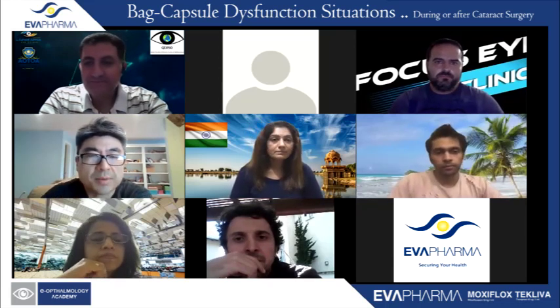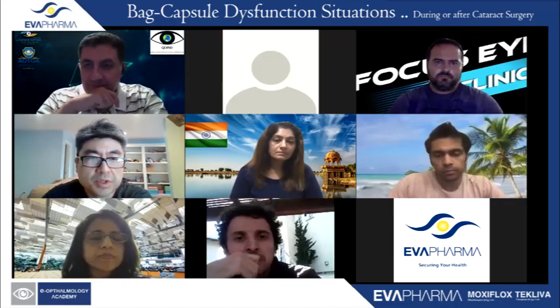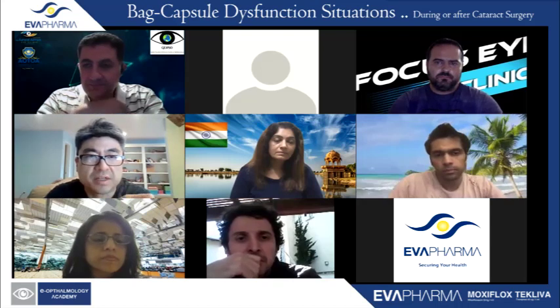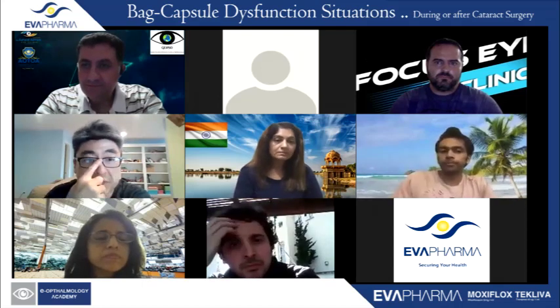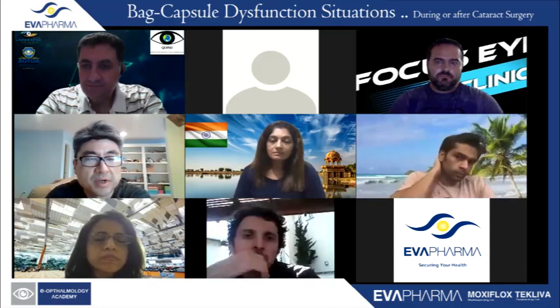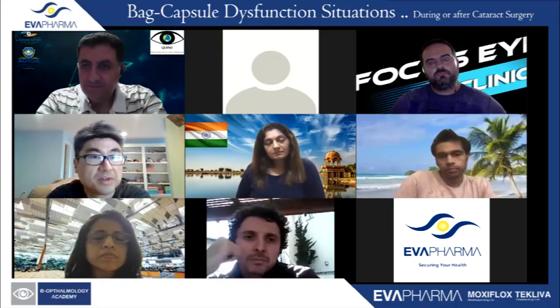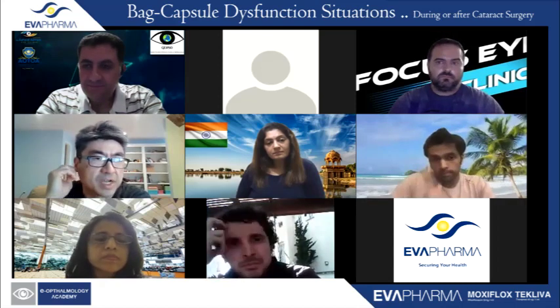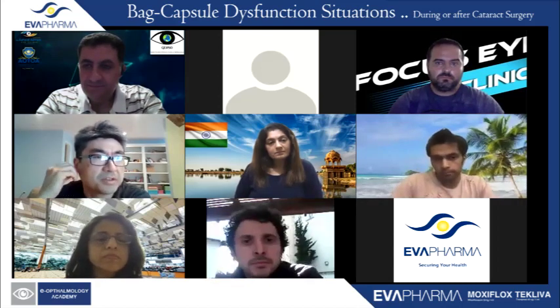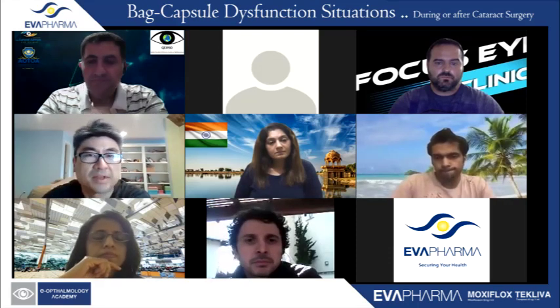One quick comment on case number 2. Do you think maybe if you just isolated the hole or the tear with dispersive viscoelastic, you could have been able to spare doing the vitrectomy? Sometimes I understand why you did the vitrectomy, but unless it actually presented itself, I don't know. If the hyaloid face is intact, you should be able to continue the case without having to do the vitrectomy until a little bit later. That was my only comment.